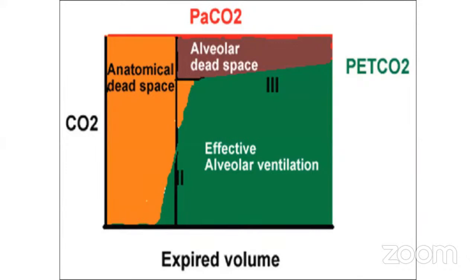So I want to ask, there also she has written PaCO2 minus ETCO2 is the gradient. If it is more than 7, dead space ventilation is there. But if I want to know what the FeCO2 is? Okay, David, we'll clarify it next.